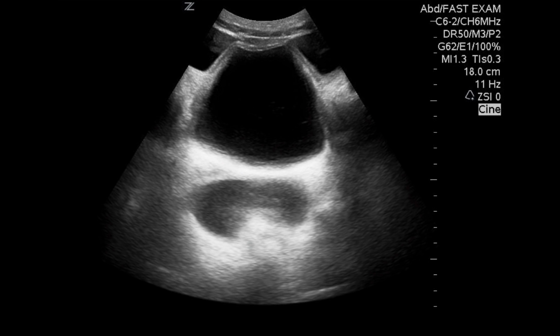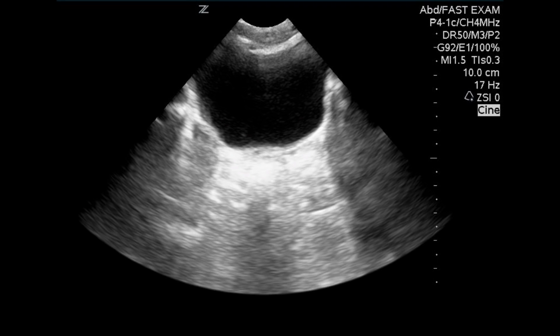You can see here behind the fluid-filled bladder, the soft tissue is very echogenic and very bright, much more than the surrounding structures. And this is because the sound that has traveled through the bladder has not been weakened, as it has only traveled through fluid rather than tissue compared to the lateral aspect. And the sound that is reflected is much stronger, meaning much brighter.